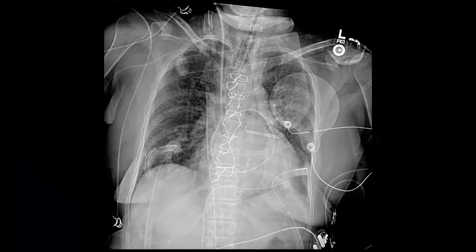Hey everybody, it's Dr. Sajewicz here. I just wanted to show you an ICU chest x-ray and go over what all these different things are on top of or inside the patient. This looks all kind of confusing, doesn't it? So let's just start from the very beginning.